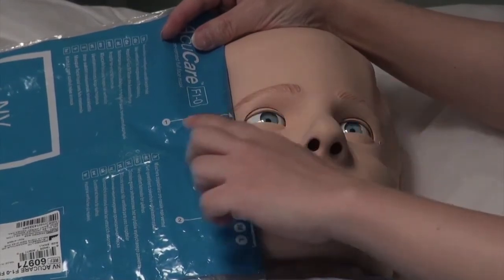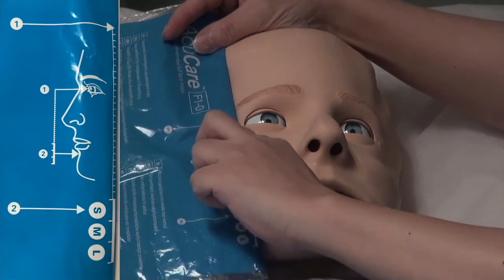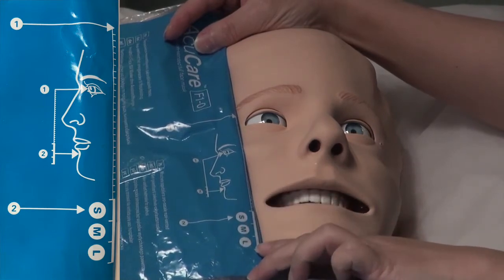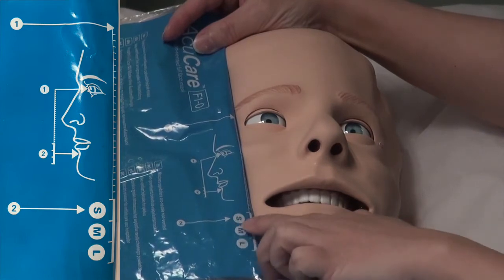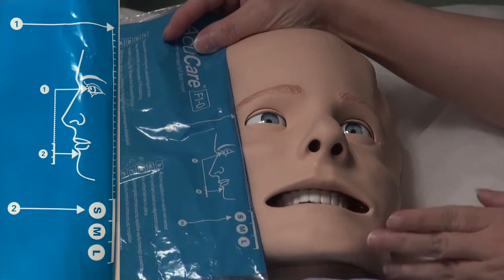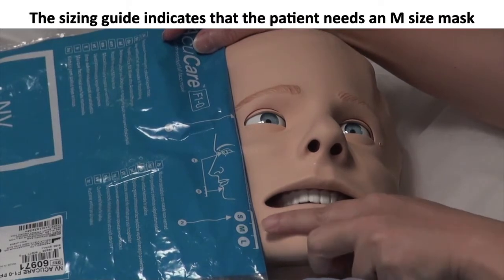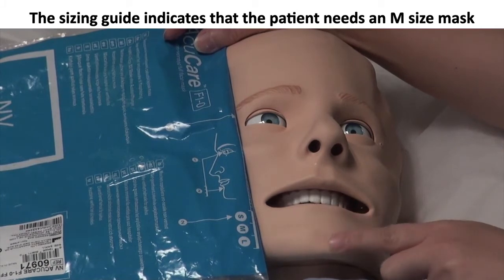The one labeled arrow here should be at the center of the eyeball. And then follow the sizing guide down. Keep your patient's mouth slightly open, like this. Look at the sizes here. For this face, the size should be M. It should be slightly lower than the lower lip and above the angle of the chin.